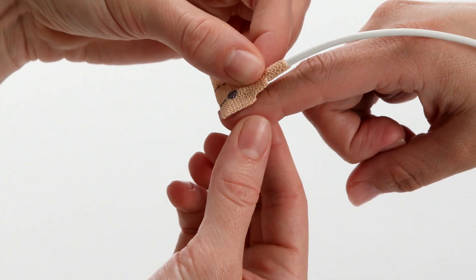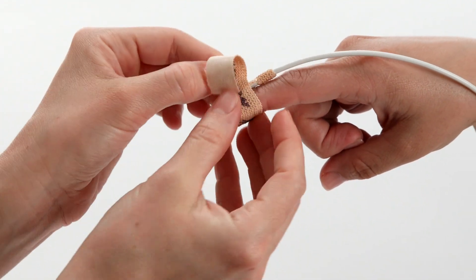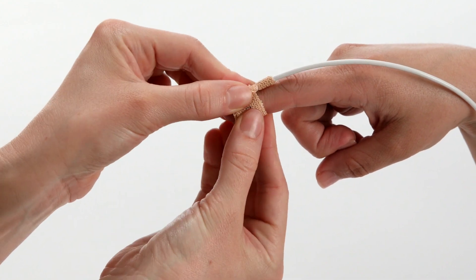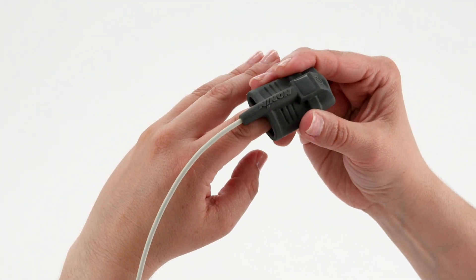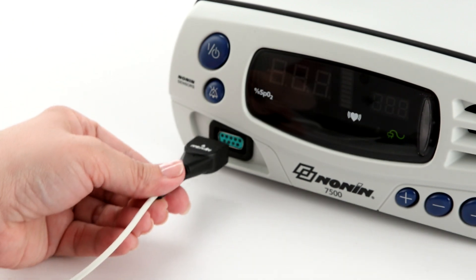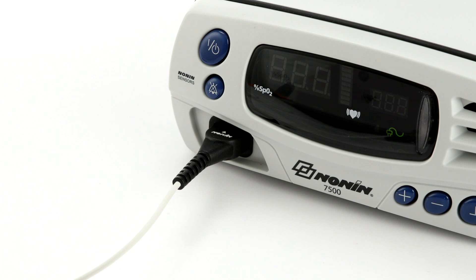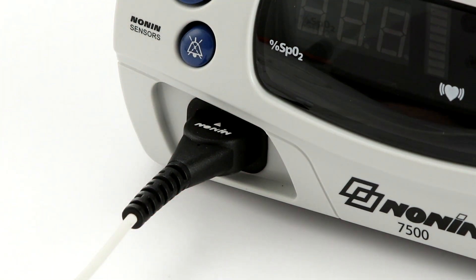Prepare the sensor and place it on the patient prior to connecting it to the oximeter. Proper sensor placement is critical for accurate readings. Follow the instructions for each sensor type to ensure secure, aligned positioning of the sensor on the finger or skin surface. Connect the sensor to the pulse oximeter by inserting the plug with the Nonin logo facing up into the sensor port on the front of the oximeter as shown here. The connector should fit firmly in the connector port.